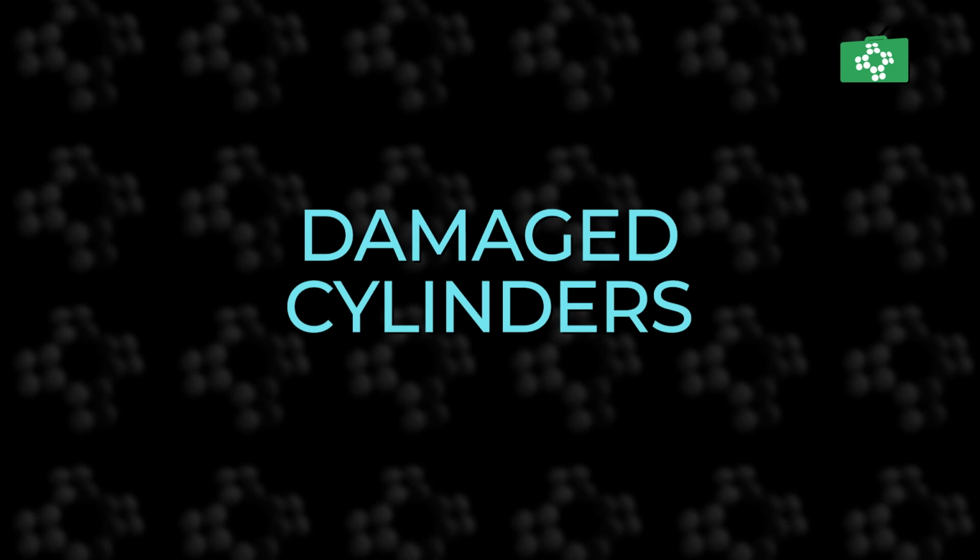If you think that you've damaged a cylinder in some way and there are visible signs of damage, that cylinder should be labelled up or tagged and put away so that nobody can use it, and the supplier should be contacted immediately. The supplier will come out and swap it for another cylinder.